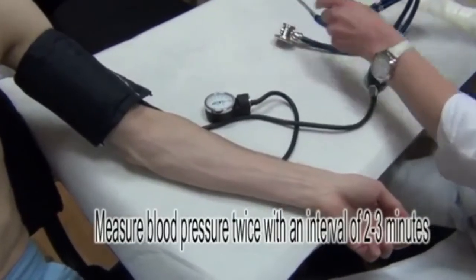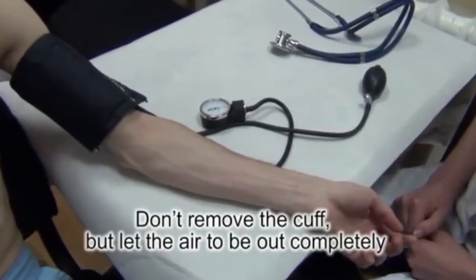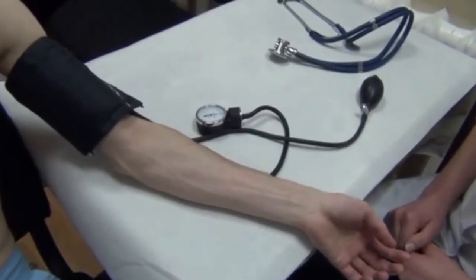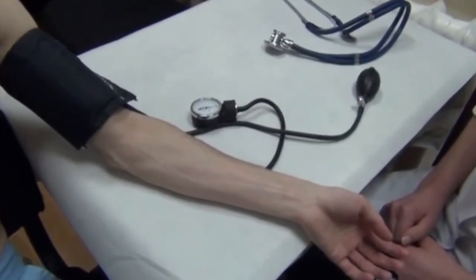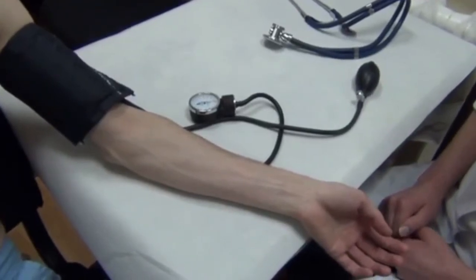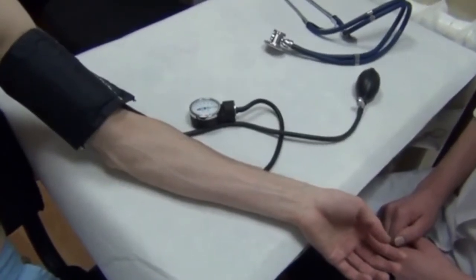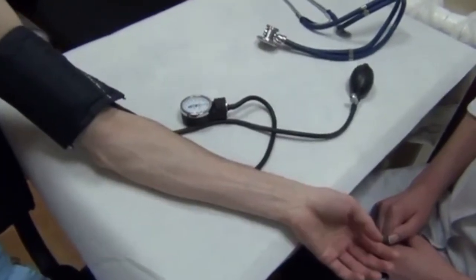As a rule, we should measure blood pressure on one brachium no less than two times. We do not remove the cuff from the brachium, but fully deflate the air from it. After 2-3 minutes of rest, we repeat the blood pressure measurement. Both systolic and diastolic blood pressure are recorded as the mean value between the two consecutive measurements, respectively.